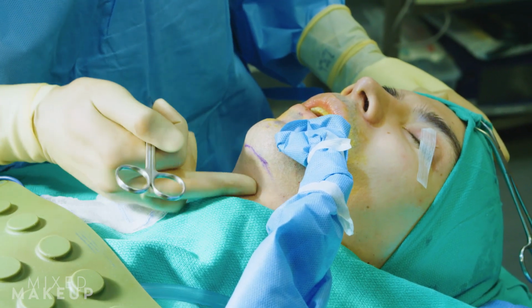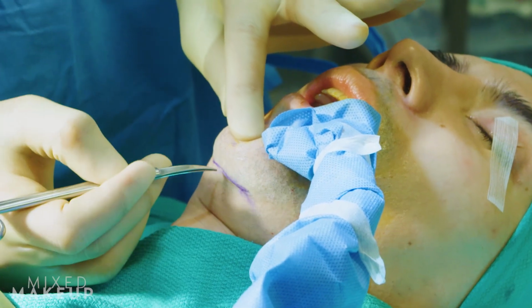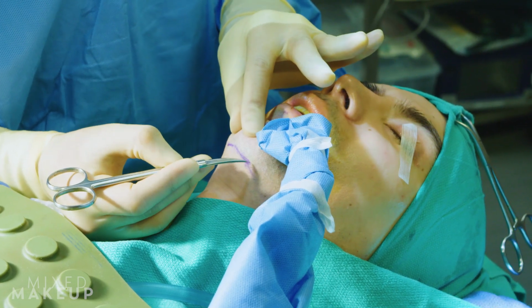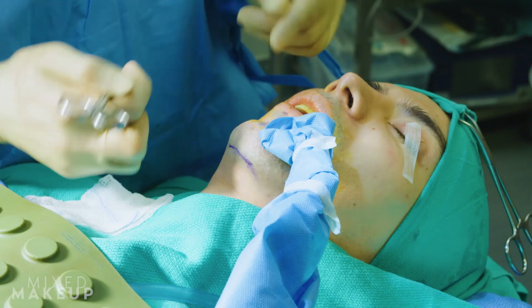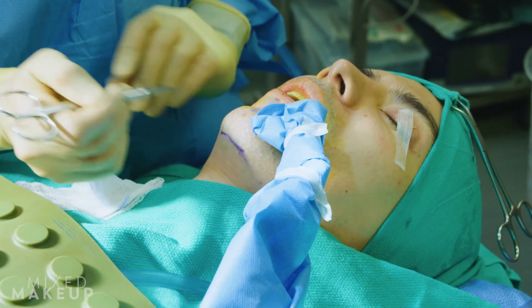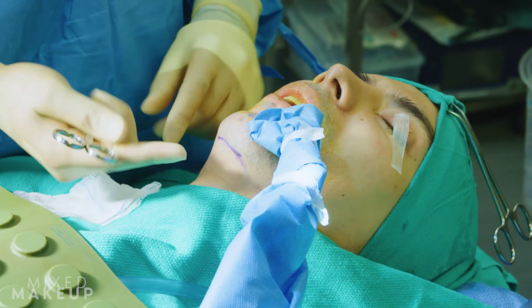If he did not have a scar, we all have a crease. So if I do this, when we put our chin down, there's a natural crease that forms, so that's actually a perfect place to place an incision. So I'm going to use the same place that he has an incision to start, but this is where it's going to be hidden under the chin line. That gives me access to the front. We're going to go through the mouth for the 2 other incisions, 1 on each side. And once I elevate everything up to bone, you'll see how it gets placed, and then we sew them up. It'll be about 2 to 3 hours.